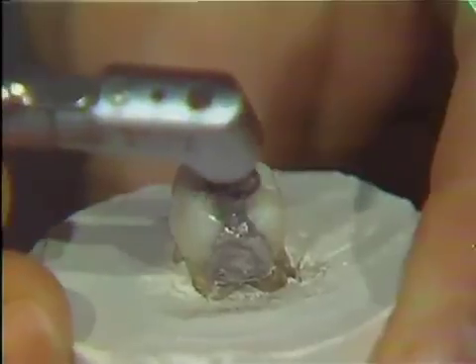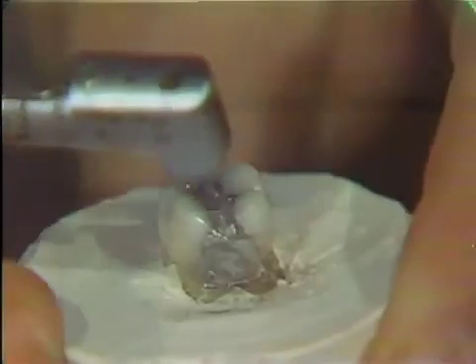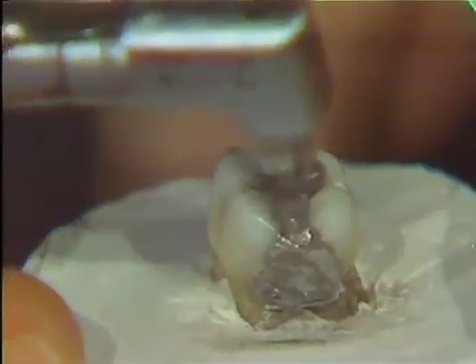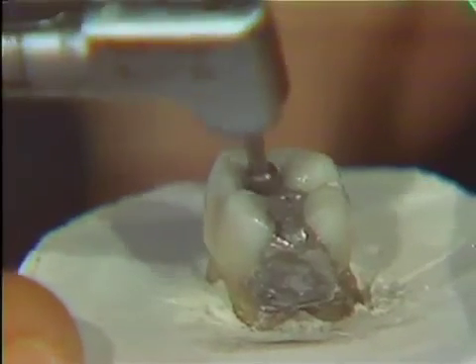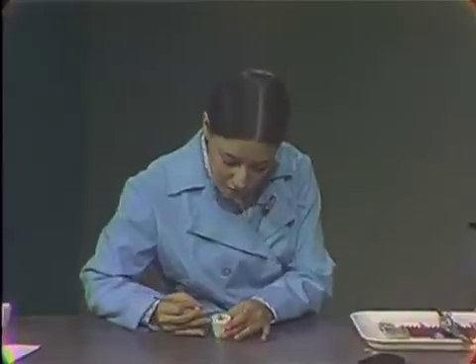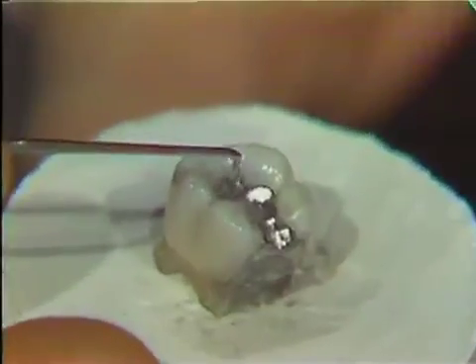You may notice there is a slightly wrinkled or pitted effect on the surface of the amalgam, and this burr is excellent for putting a high finish — a very smooth, high finish. It's a rare amalgam that can't be finished down to the consistency of almost satin. And if you look closely, you'll see how smooth the surface has become. There's no more pitting or roughness — it's just the consistency of satin.